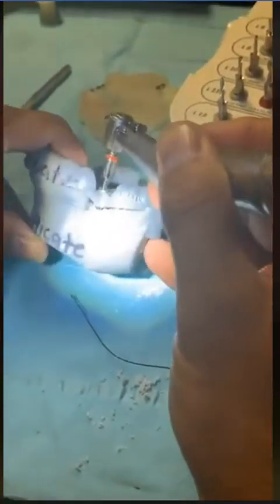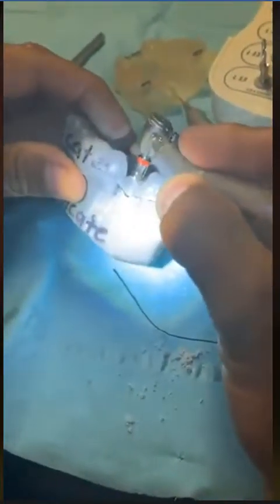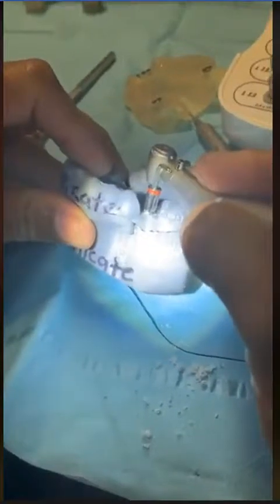But here is the next burr. Take a look. The next burr I'm going to come in, same thing, does not engage. You see that? Does not engage. So now we have to go back to the 6 millimeter burr for the next one. You open it up a little bit, put the 13 all the way down.